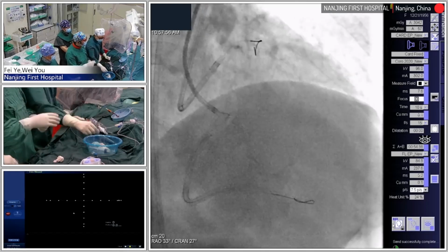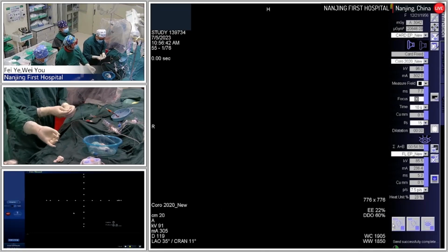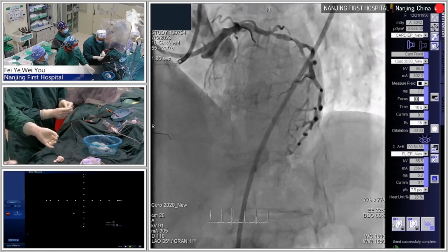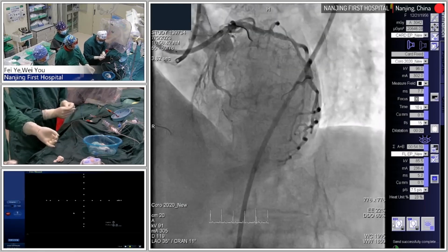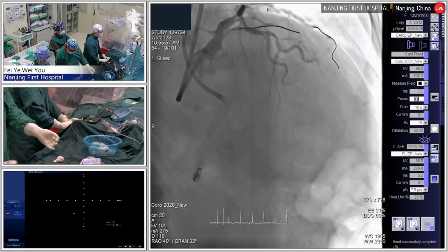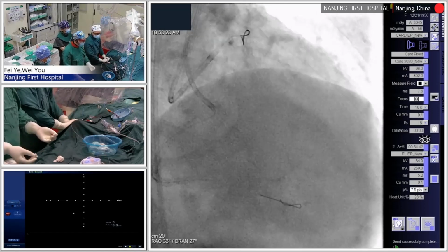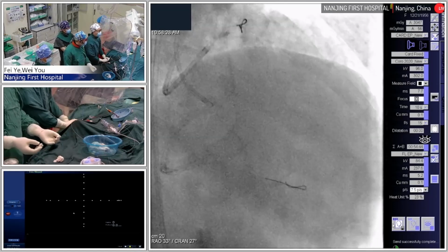Microcatheter, please. So previous angle. And prepare a new SUOH 03. New one, please. Previous one. Use... We only have CR, right? Okay, give me CR.